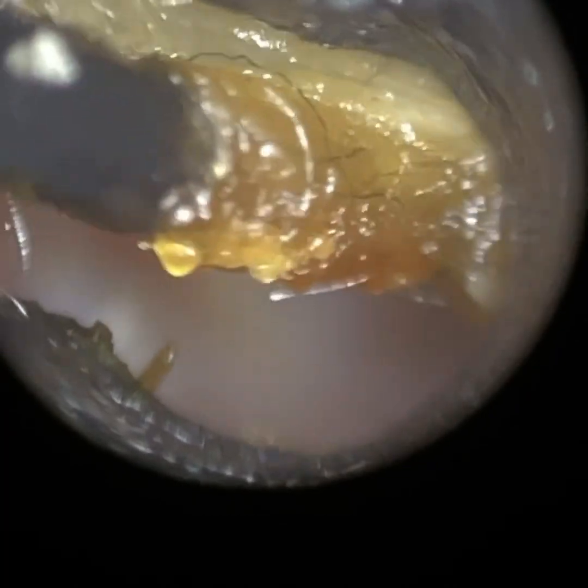They're very impressed by the view. Obviously they said it was different because of the field of view, but they're very impressed by the magnification and the clarity — really amazing. You can even see in that keratin a few hair strands mixed in. So that's the magnification, focus, and clarity provided by the Waxscope.